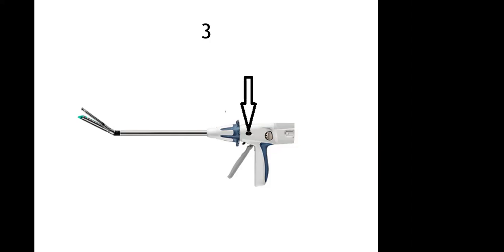Next, mention any one surgery where you have seen this being used. It can be used for laparoscopic gastrojejunostomy, like Whipple's operation, gastrojejunostomy, jejunostomy.